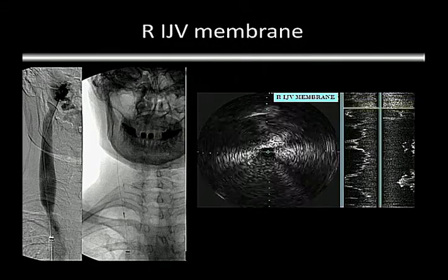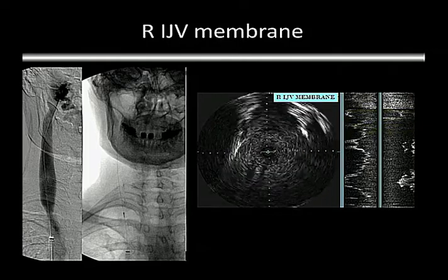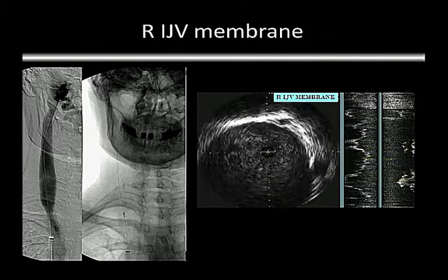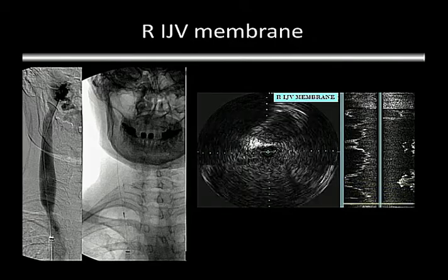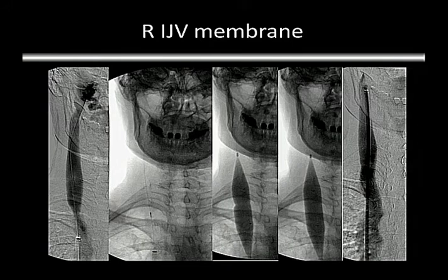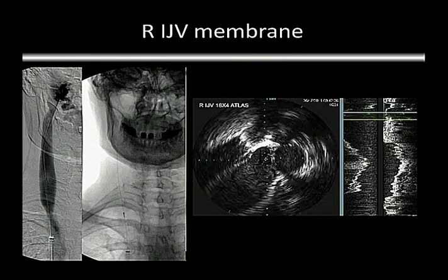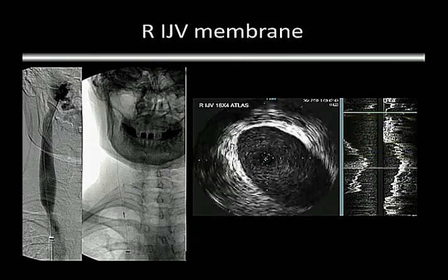Here you can see that it's just nothing, and then it opens up. So I know the point of stenosis is right there. And I can place the shoulder of my balloon right at that point and kind of spare the rest of the jugular vein. And here's the outcome, looks pretty good. But I didn't dilate the whole vein up here at all. I preferably would have liked it even lower to get this. You see the waist is right where that's my marker. So I could have moved this balloon down even lower so that most of this tapering balloon would be up here, wouldn't even be touching the wall. And I think that's the follow-up. Yeah, it's completely open now.